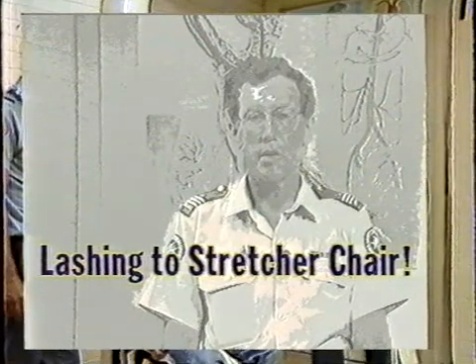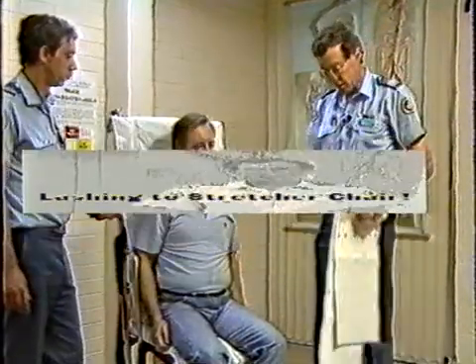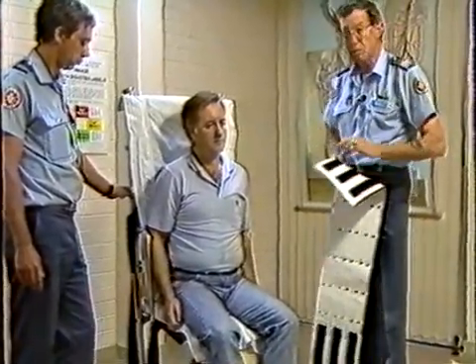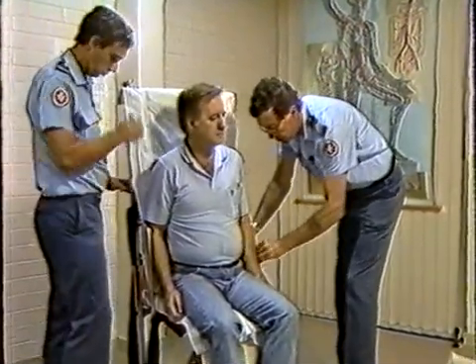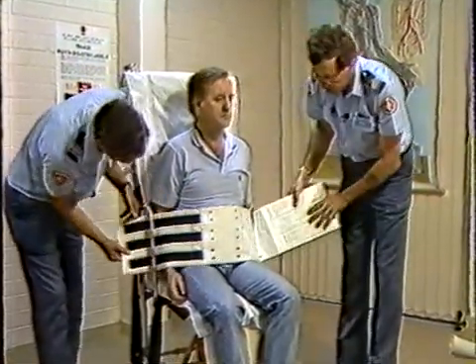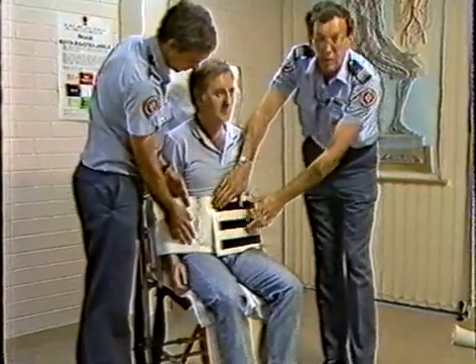In this case here, we'll presume the patient's conscious but is unable to walk. So in this instance, we're just going to lash them to the stretcher for their security, so that as we're going down the stairs, the patient's not going to be in too much trouble. So once again, we'll do the same as the lashing procedure. We'll go over, under the rail, and surprise, surprise, it doesn't make the journey.